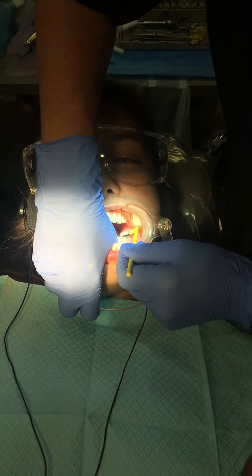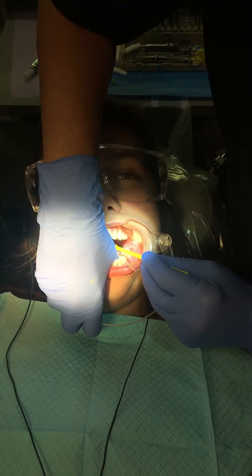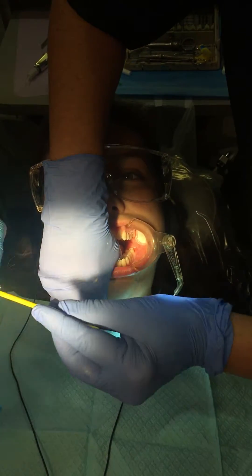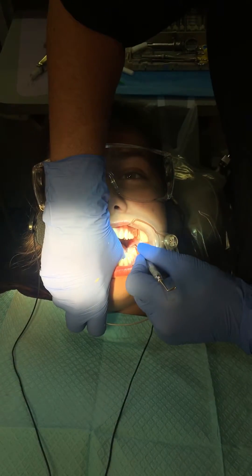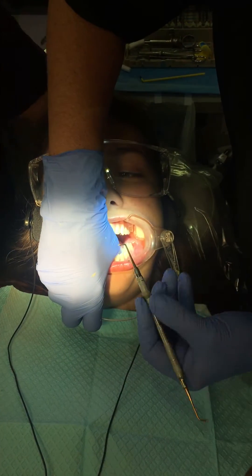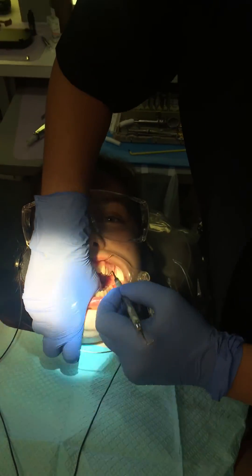And that's as easy as it is. We're going to wait for the material to harden. If the sealant falls out in the next couple of years, it's no problem — it's gotten us really through the critical stage of the decay process. It leaves Tori potentially decay-free in these molars, and we hope that she has these molars for the rest of her life. Thank you.